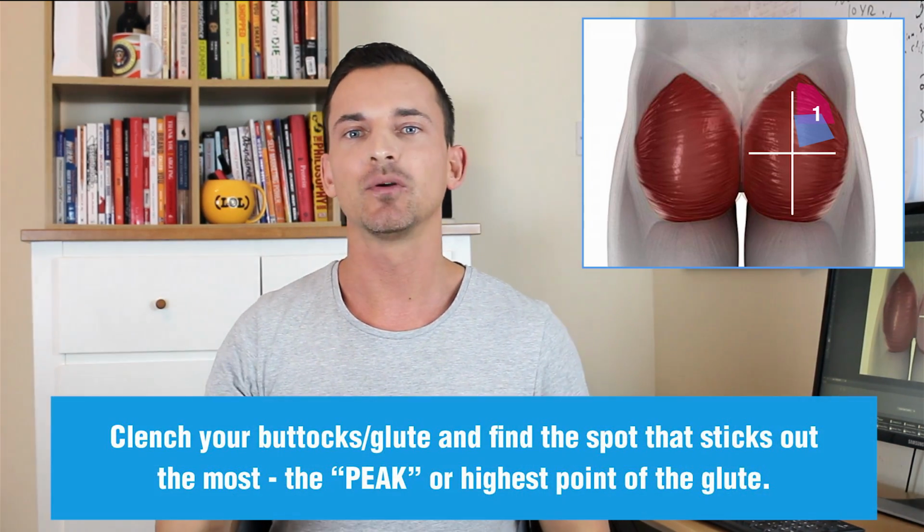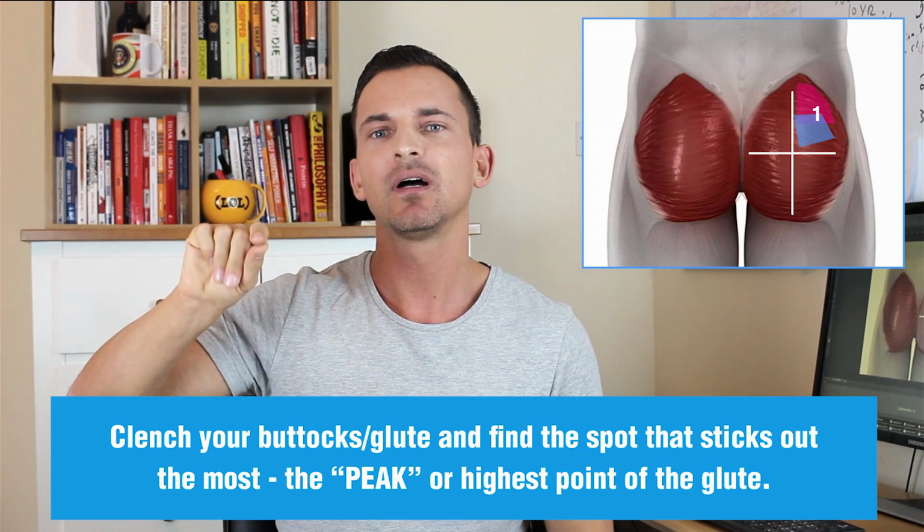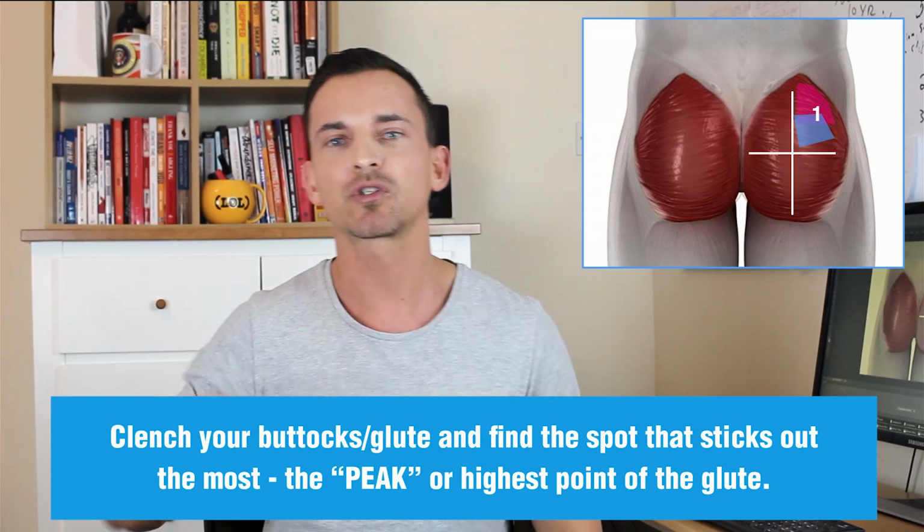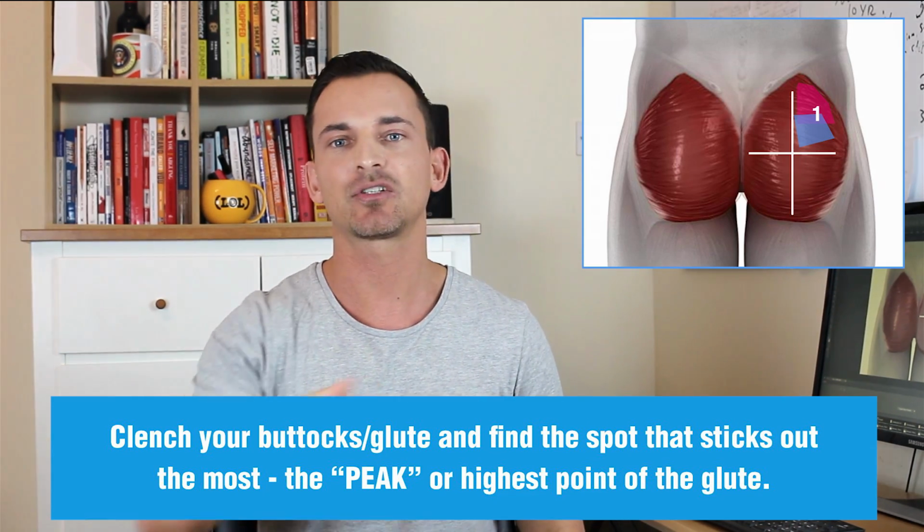So the way I've found works the absolute best, and it relates to the picture you see on screen here, is that I clench my glute muscle before I select the spot where I'm going to inject. When I clench the glute, it bulges up a little bit and makes a nice round area where it's all clenched in, really showing the muscle. Then I pick the top outer area of that and rub it with an alcohol swab so that it's wet and I know where that spot is, and then I grab my needle and syringe and inject into that spot.